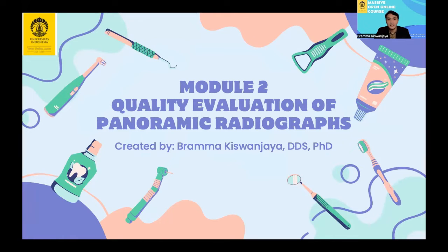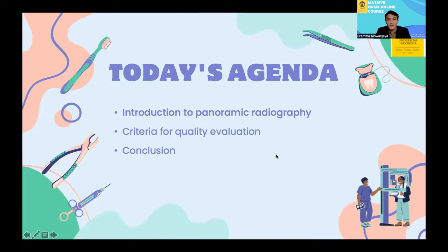The title of the second module is the Quality Evaluation of Panoramic Radiographs. Let's begin by taking a look at today's agenda for Module 2. We will start with an introduction to panoramic radiography, followed by the criteria for quality evaluation, and we will conclude with a summary of the key points.